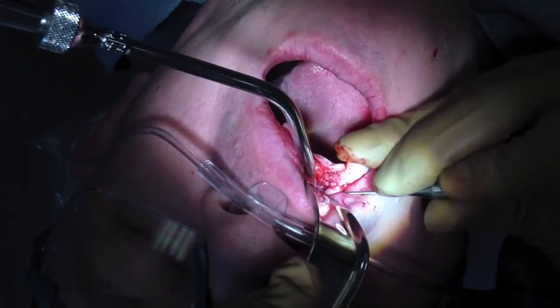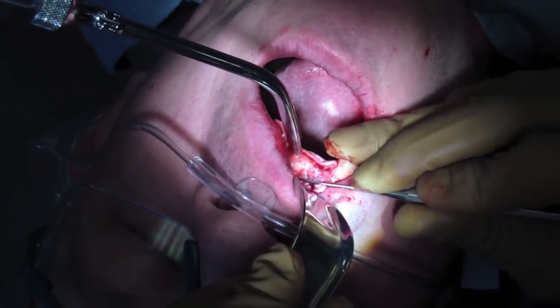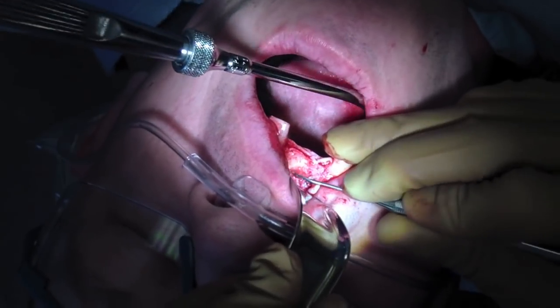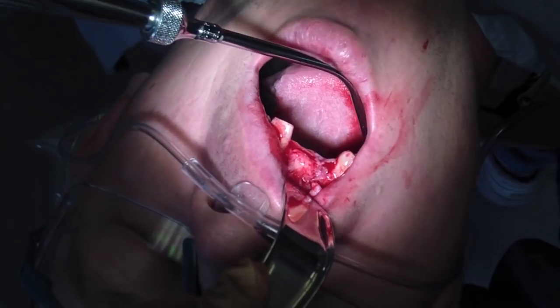As I'm reflecting the tissue, you can see the extraction socket. I wish I took more photos — it'd be a really good opportunity for newbies to see how an extraction socket heals. It's about four weeks out.